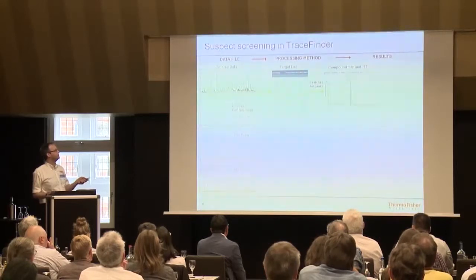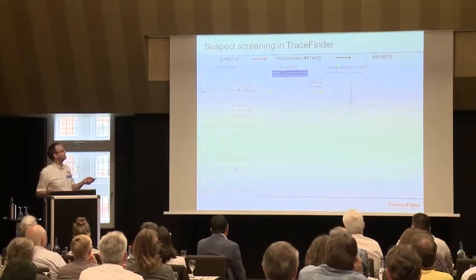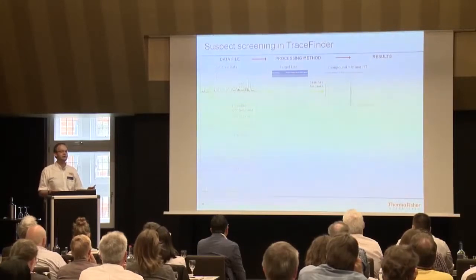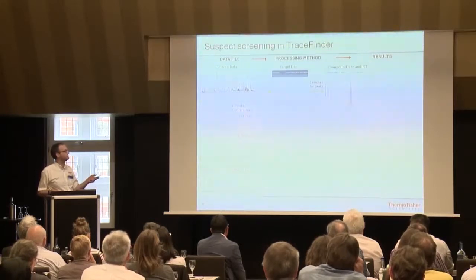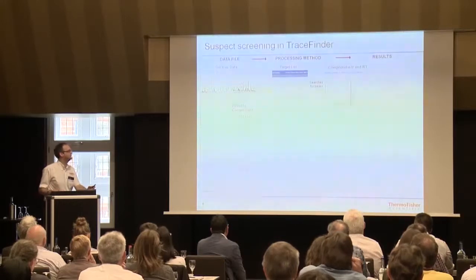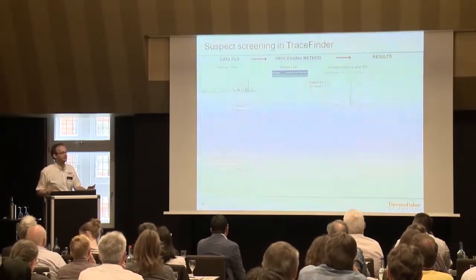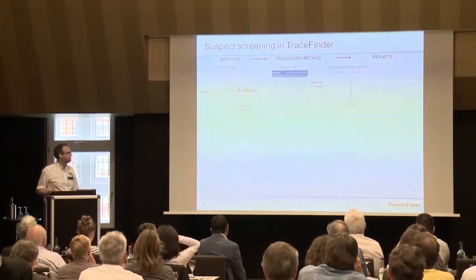And because we have the m/z, which is accurate and high resolved, and we have a retention time in most cases, that will put a name onto that, because we run a list where this retention time and the m/z have been laid down. So that gives us a name. But of course, that's not the point to go to. That's quite easy and has been done for a long time.